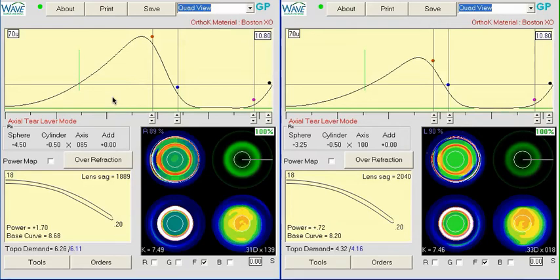I have done monovision with presbyopes, but not any lenses where each individual lens has multifocal optics in it. With Wave, I guess theoretically the two ways you could do it is to create a lens with a very small OZ, so maybe 3.5 or 4 millimeters, and then the corresponding IC that could mimic a distance center lens.